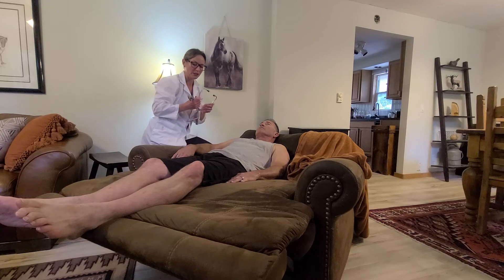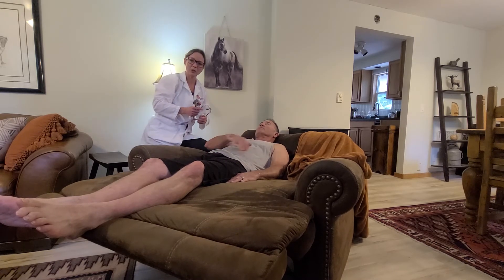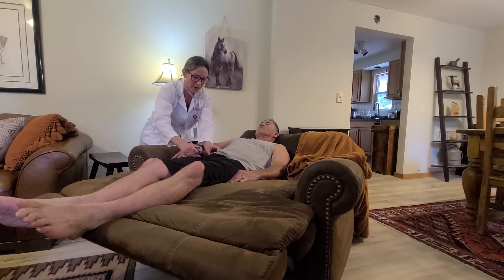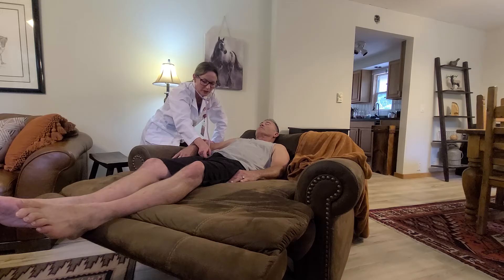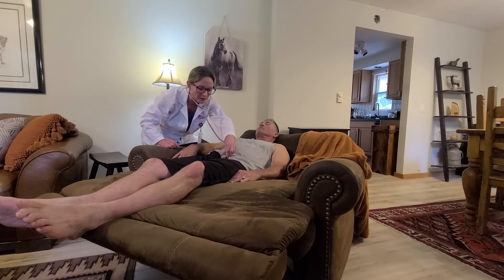I'm going to listen to the femoral arteries. I would have them lower the drape in clinic, but for modesty I'll have them keep the trousers up. I'm auscultating here in the femoral artery with the diaphragm and the bell. There are no bruits or turbulence — it is a smooth sound with a regular rhythm right in the 70s. Same findings on the other side with the diaphragm and the bell.